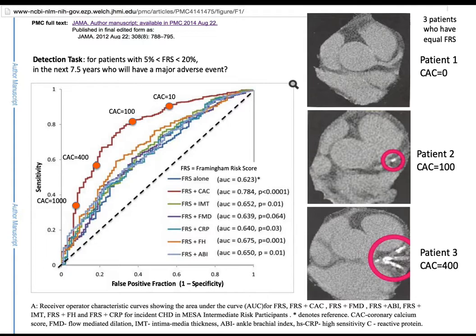Another application that actually probably predates some of the modern CT scanners is looking at coronary artery calcium. In this scan, you don't inject any contrast agent because the calcium already is bright on CT. It looks like bone, right? And having that bright signal in the locations of your coronaries is a bad idea and a harbinger of adverse cardiac events.